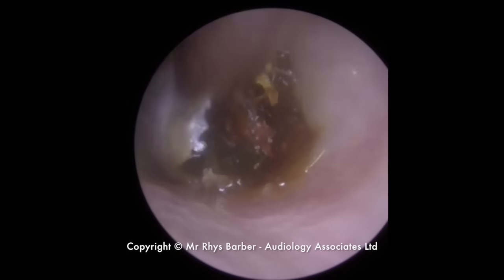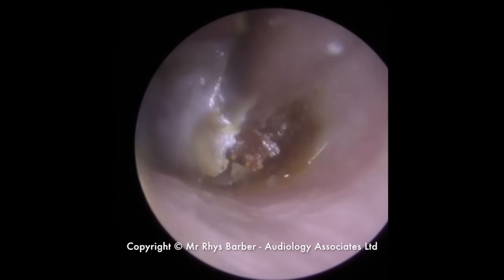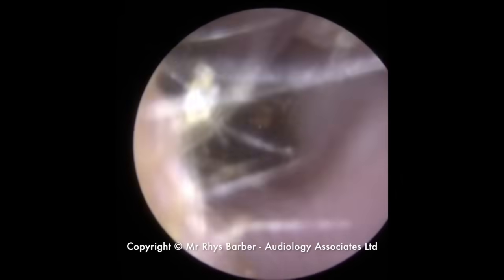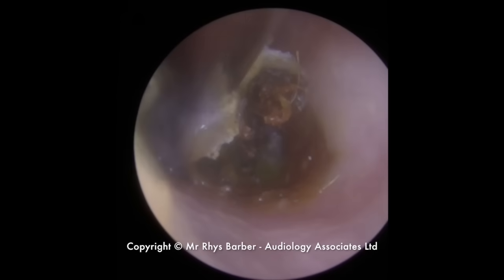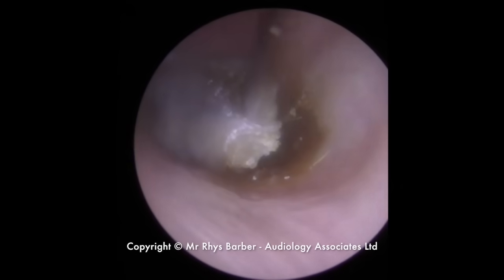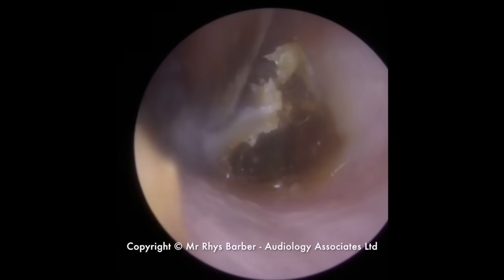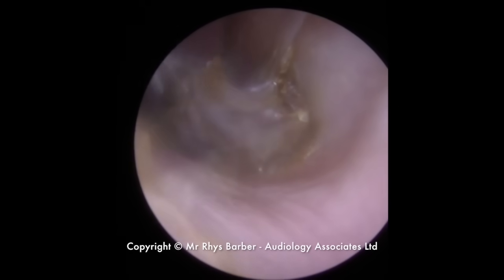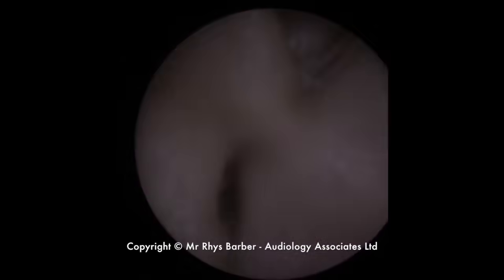Just trying to manoeuvre this wax, but it's so difficult because we've got to be conscious of the wax and trying to manoeuvre the skin into the right position to get a good grip on it with the suction — it's proving a little bit difficult. Just starting to turn it, there you go, see a piece of this old skin coming away.